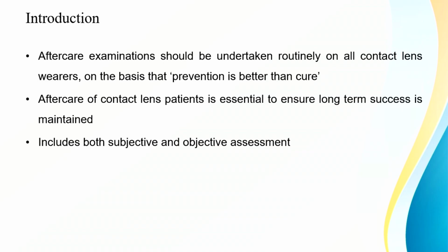We don't like dropouts, right? We have dispensed some lens to someone. They shouldn't be a dropout. They have to successfully continue their lens wear. So aftercare gives you an idea of how they are using and handling techniques. If there is any discrepancy, we can still correct it and make them successful. And this includes both subjective and objective from our side and also from the patient side as well.